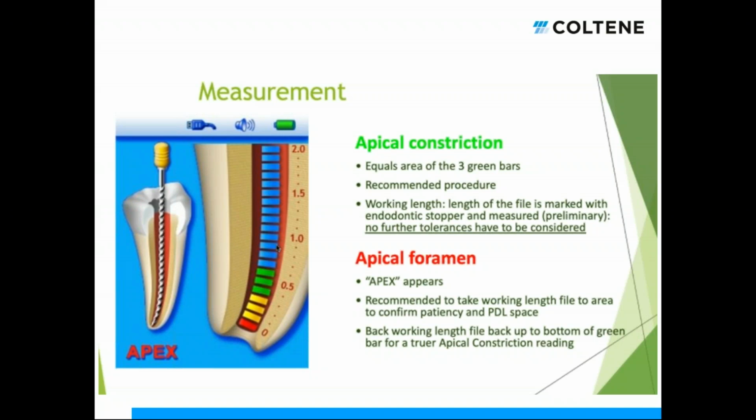Yeah. Meredith, am I crazy? No. Absolutely, 100%. It should be at least to the third yellow bar and be able to get into the conversation of why. I mean, show them how it goes to the apex, and then hit the M, hit the virtual. This is why I'm bringing it up to at least the yellow, whichever bar, and be able to have that conversation of the apical constriction and the apical foramen. Agreed. I have a question though. Good job, you guys.